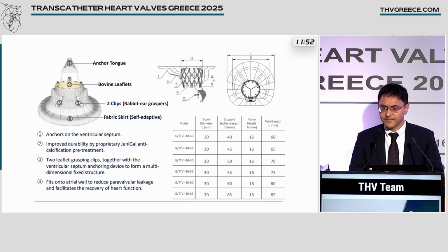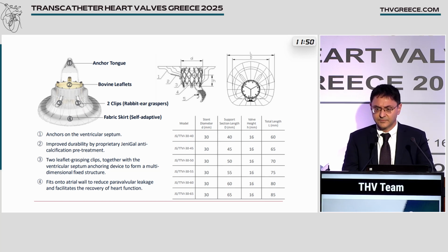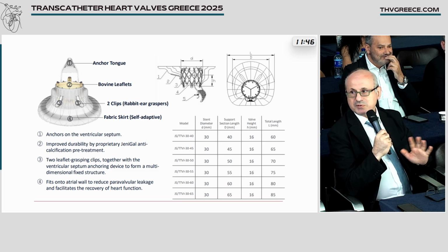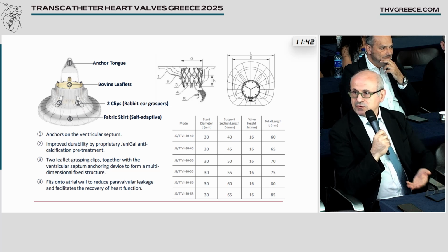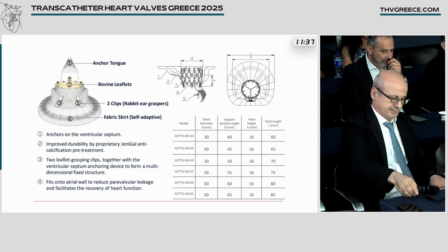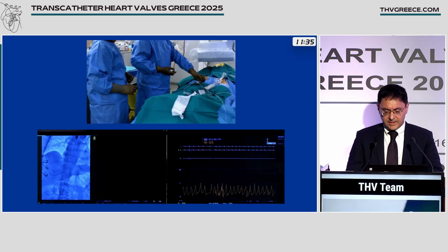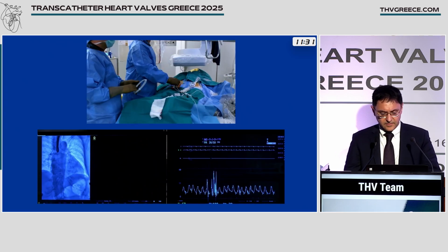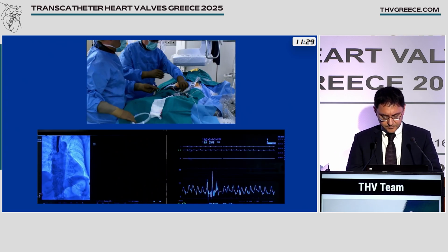Kyriakos, just to clarify, the reason this patient was excluded from Evoque was the plastered septal leaflet. The septal leaflet was on the septum, so there would be no space for the Evoque hooks to go behind. And here we see the video of the intervention.